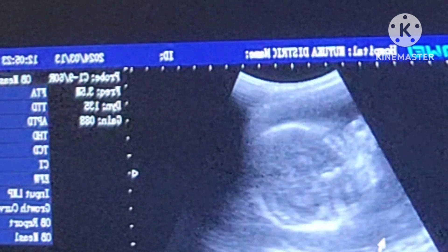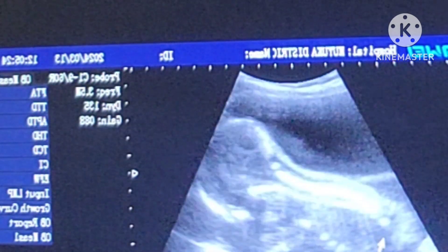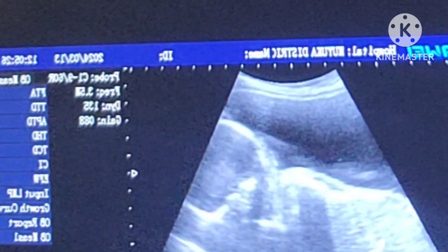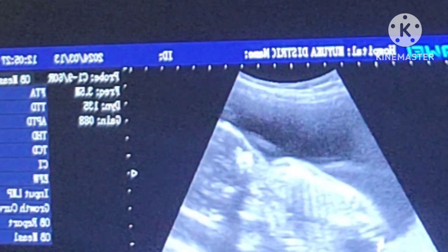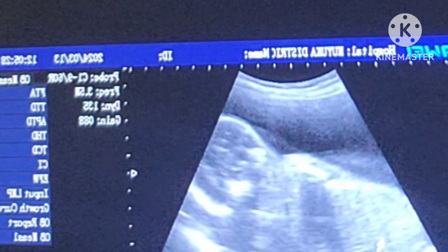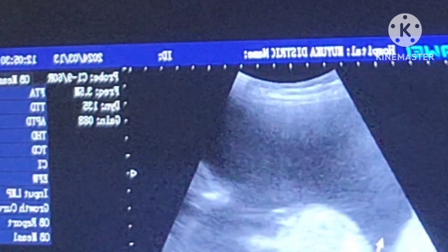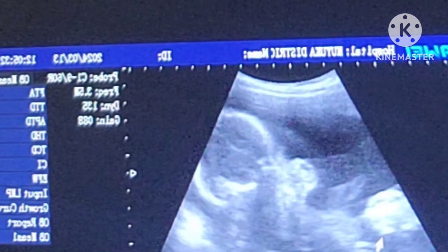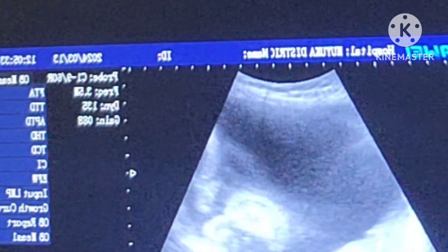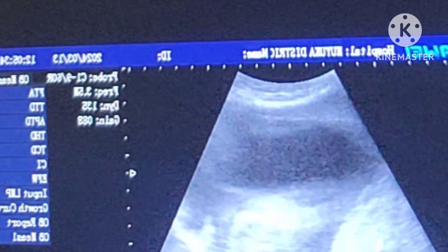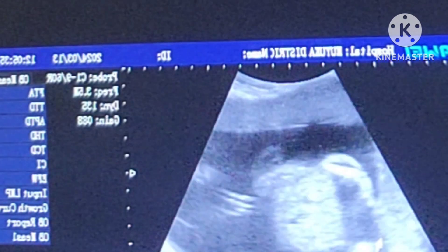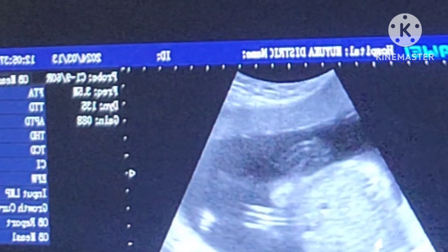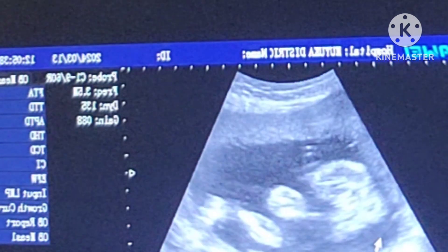The scan can check for opening or shortening of the cervix, assess fetal growth, and monitor fetal development. It can also check for congenital disabilities, hereditary conditions, or abnormalities. Additional structures examined include placenta placement, the spine, and the umbilical cord.